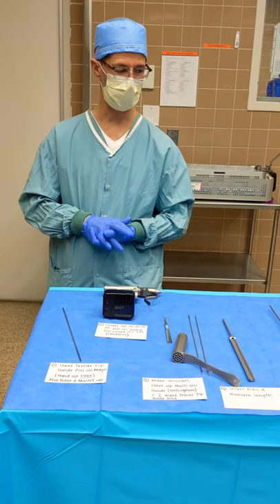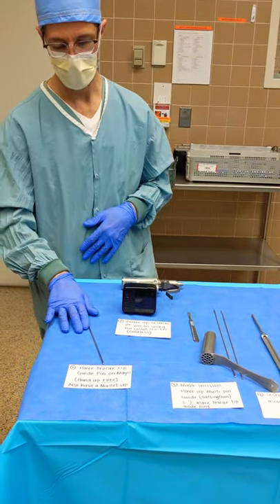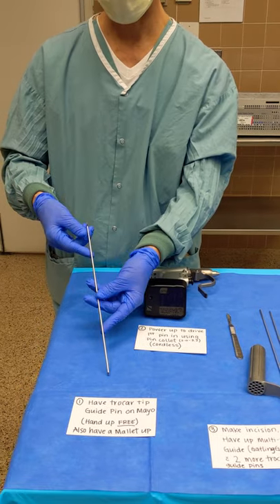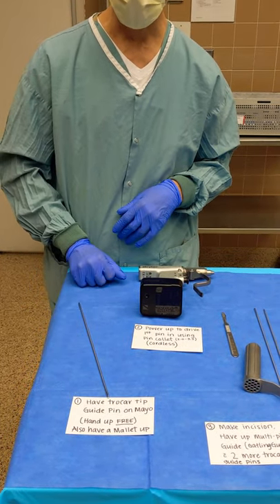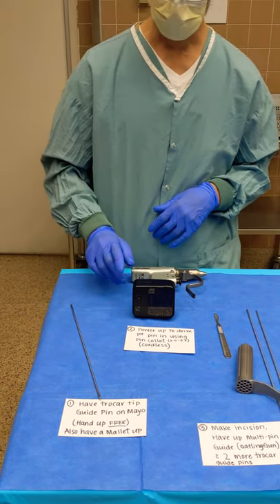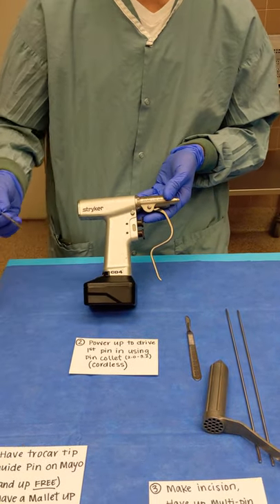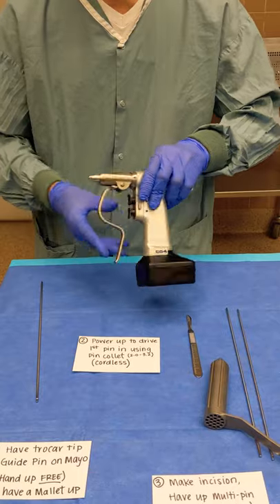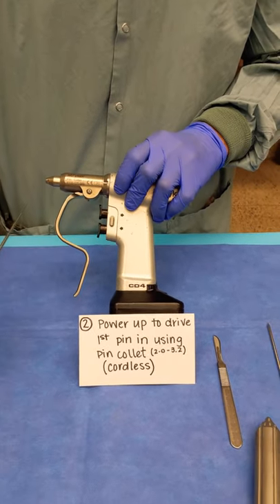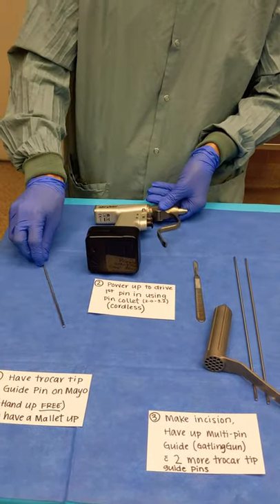These are the basic steps you're going to need to follow in order to get through this case. Step one: we're going to need some guide pins. We have a trocar tip here that you're going to have on your Mayo stand. You're going to use that pin to get some images for the entry site. Then use your cordless driver to drive the pin down into the hip. You'll use your pin collar here — these are a 3.2 millimeter diameter pin — and drive that pin into the hip, into the bone.